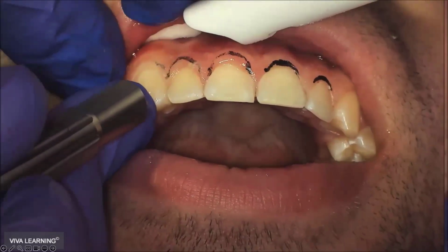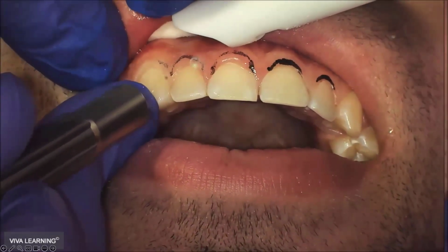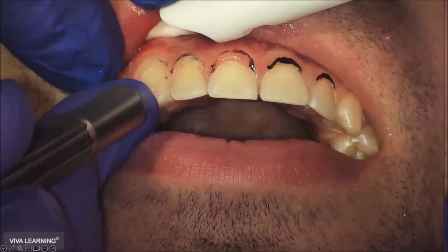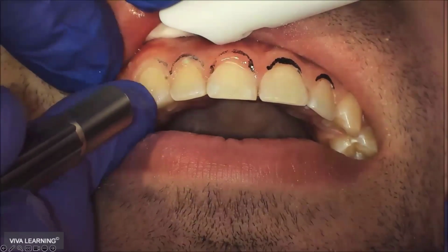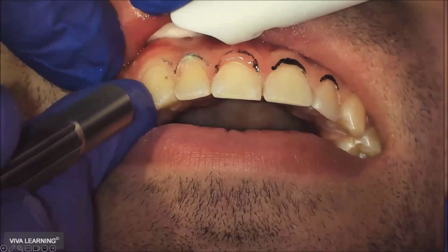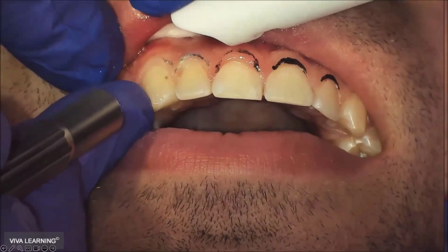Partially the reason is I'm just going at an angle where it's not going to hit it. Partially the reason is it takes such little power to cut that tissue that to cut tooth, I'd have to have it at a higher power with that foot pedal. So very, very easy to control.